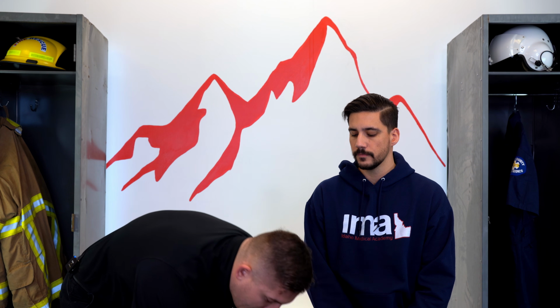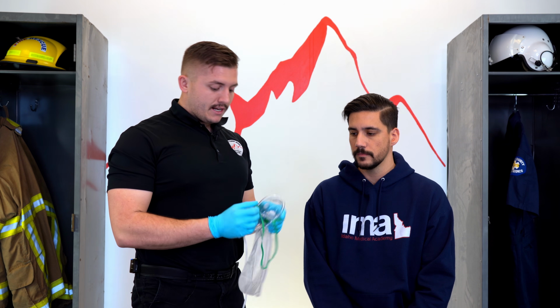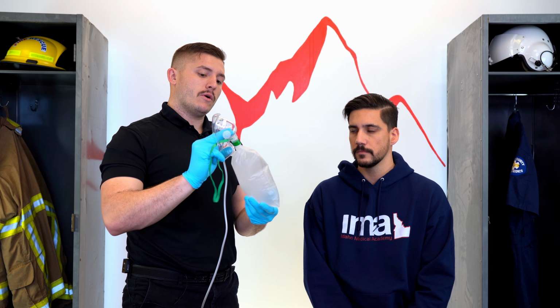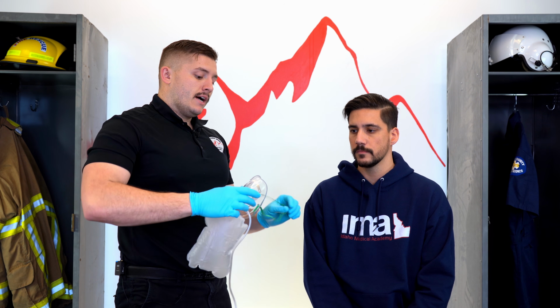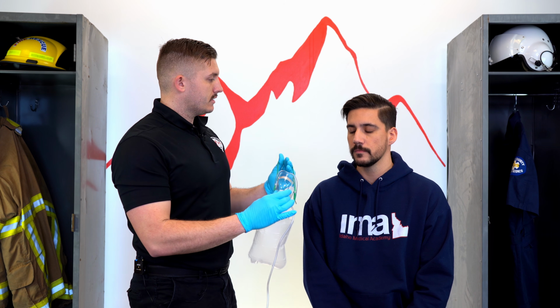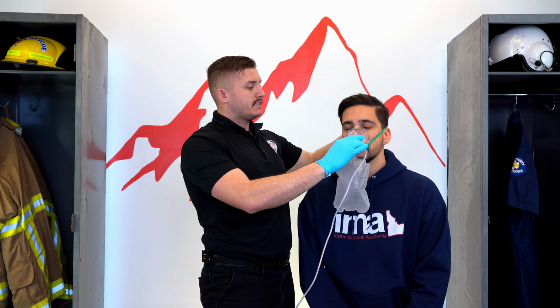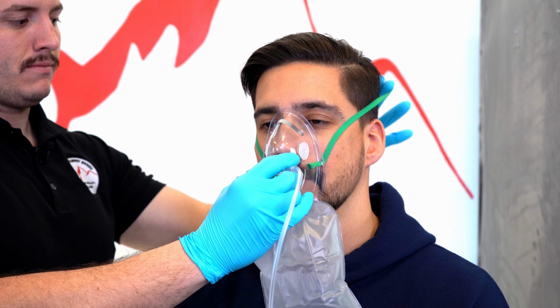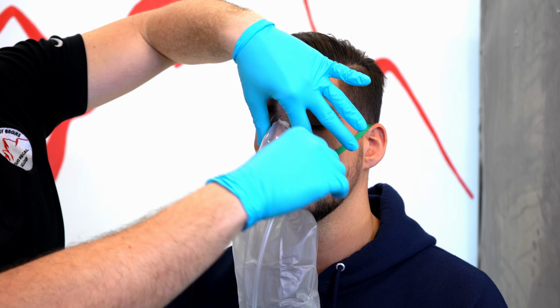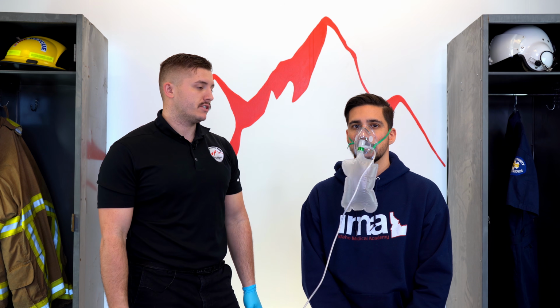Again, this is going to be flown at 10 to 15 liters per minute. I'm going to start it at 10, and if I need more oxygen, we'll go up from there. I'm going to make sure I pre-fill my reservoir bag. I'm going to place this on Wade's face. Sometimes patients can be anxious, so I'm going to say, hey, just like a mask, go ahead and take some nice, slow, deep breaths. Place the mask on, place the band just above his ears, and now I can tighten it and use this metal brace to form it to his nose, and now this fits perfectly on my patient.